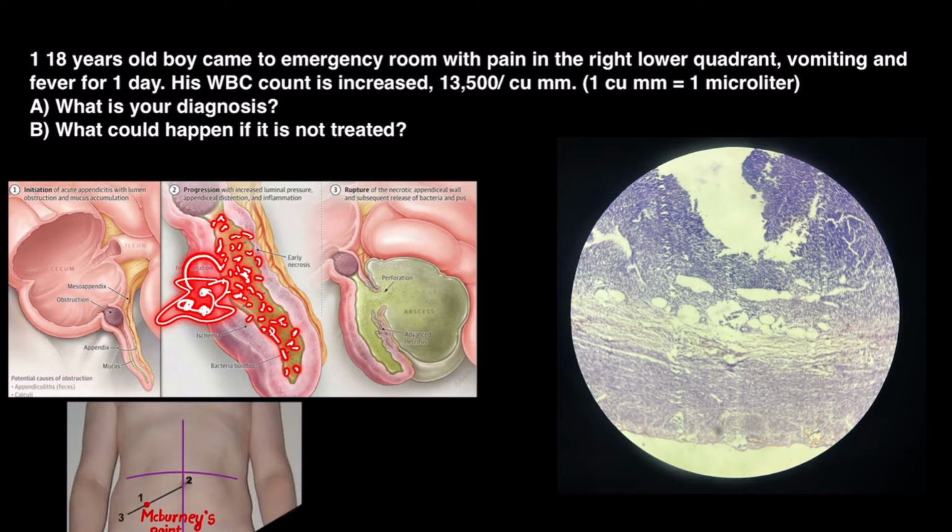When neutrophil cells invade this lumen to take care of the bacteria, there is formation of pus. For neutrophils to come, within your blood the level of neutrophils has to increase, or there must be neutrophilia. So that's why when blood is tested, an increased WBC count is seen.